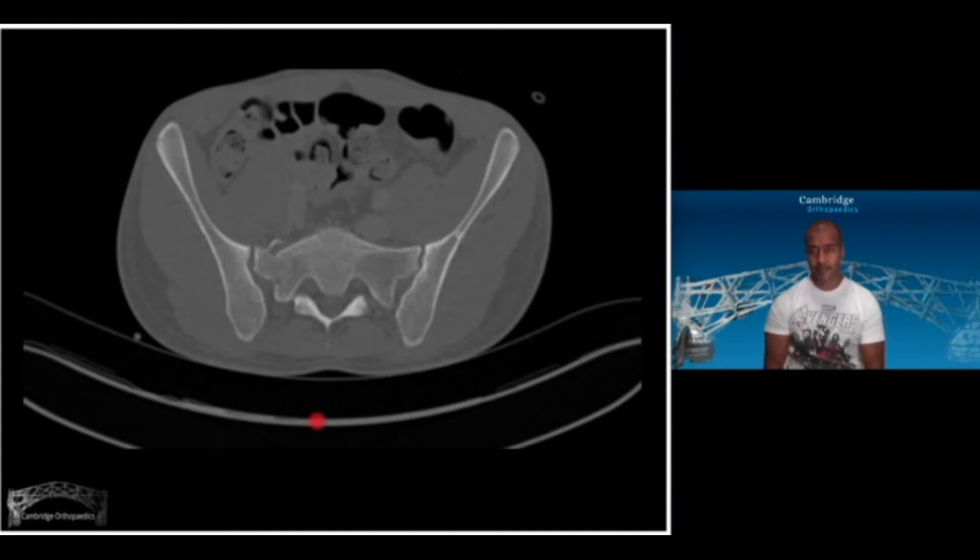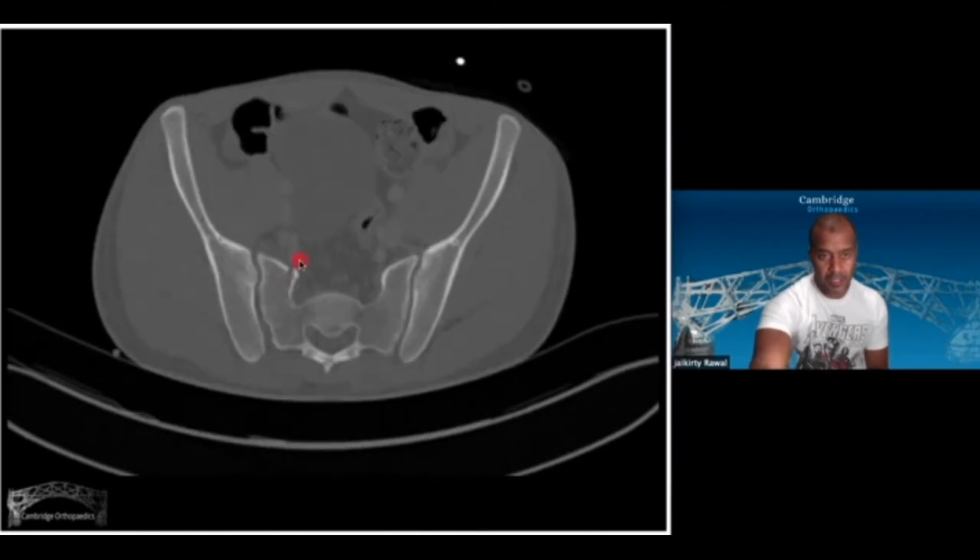Looking through this scan, I'm looking and thinking there's a normal SI joint, even though it's on the side of the fracture, and the other side looks pretty normal. Here's the alar fracture here, and there's some comminution of it. For me, a bit of comminution tends to indicate that there may be a bit of mischief, and this fracture seems to come out the back here. Here's another slice — it goes through the body of S2, out the back.